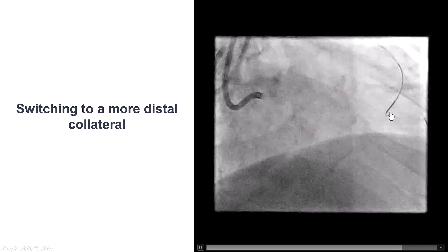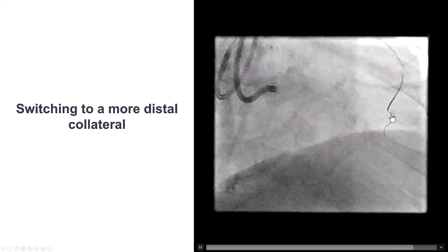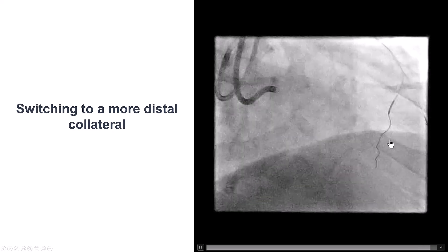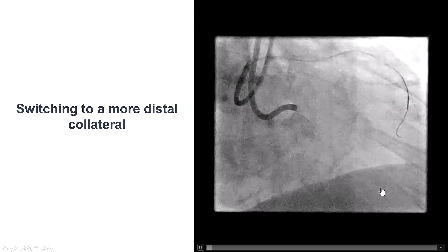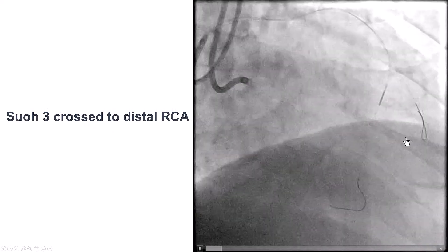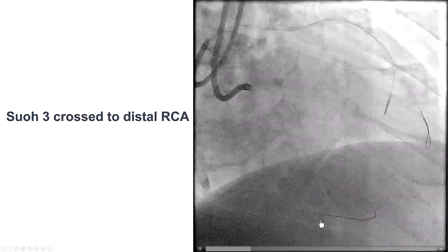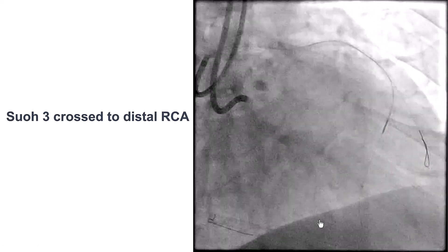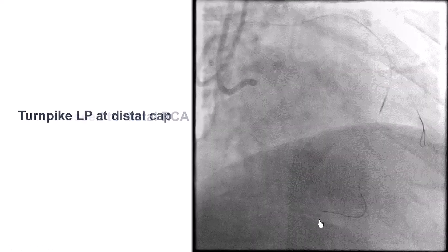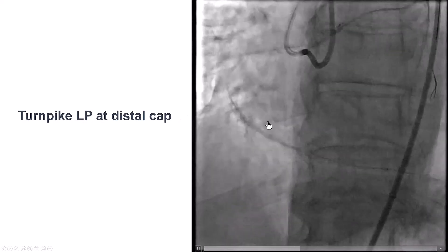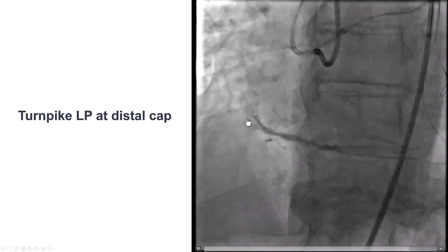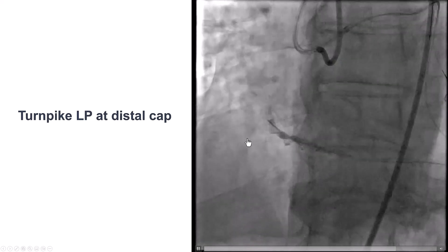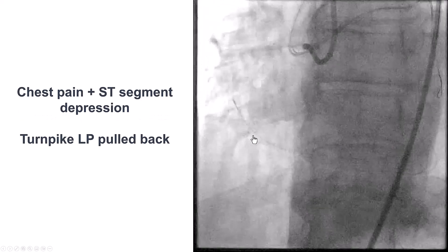We did that but had a lot of difficulty directing. Eventually, the wire took that bend, and after taking that bend it was able to advance a little further down, and we were into the right posterior descending artery. We then advanced the Turnpike LP to the distal cap and did an injection through the microcatheter, demonstrating the good quality distal vessel.